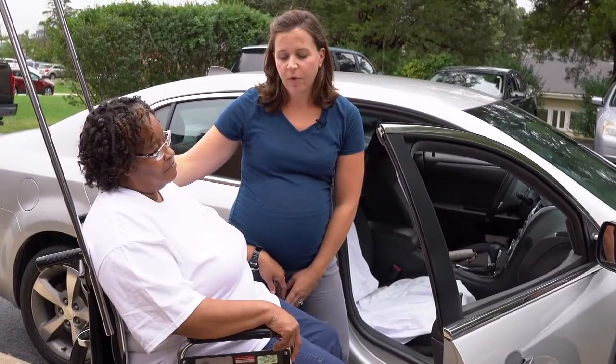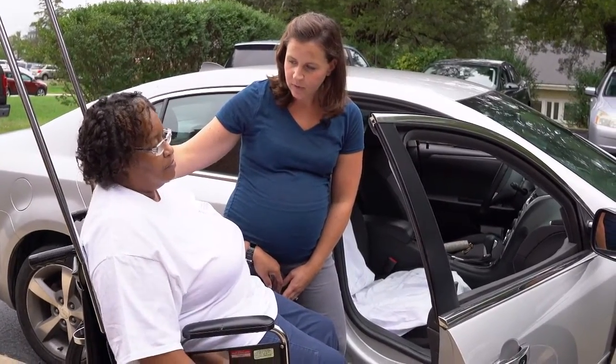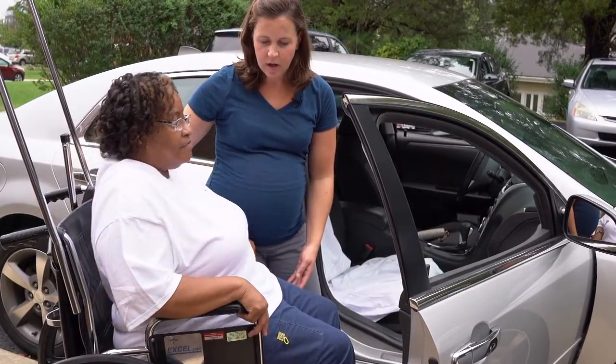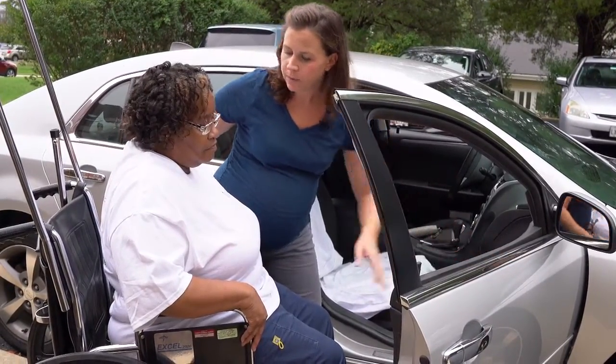Be sure before you get out of the wheelchair that the brakes are locked. Brakes on. Go ahead and scoot forward to the edge of the chair. Okay. And we're going to stand up. Remember, you can use this to help you.